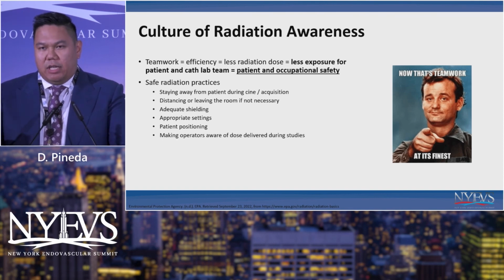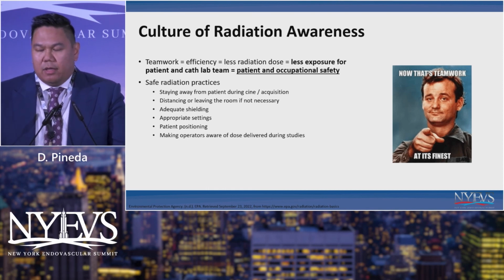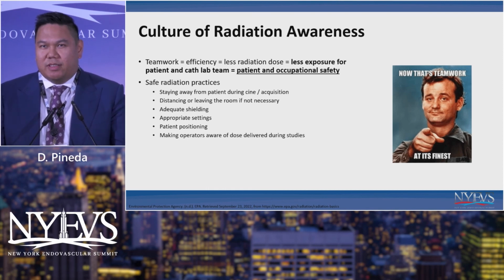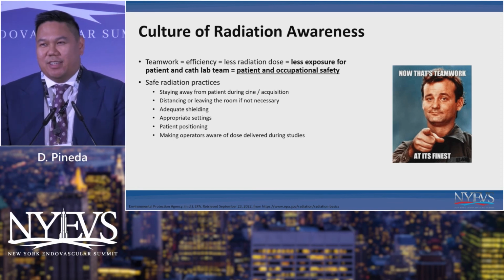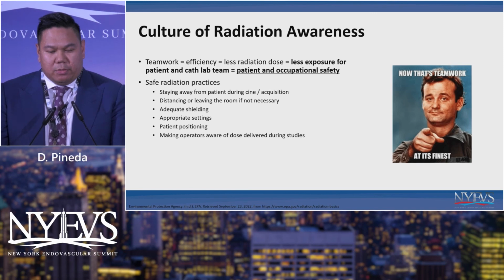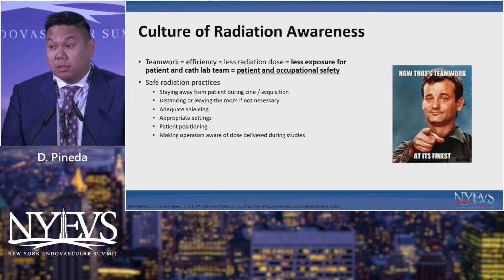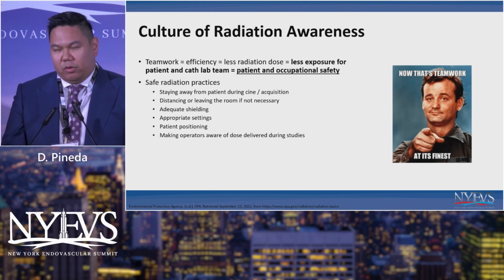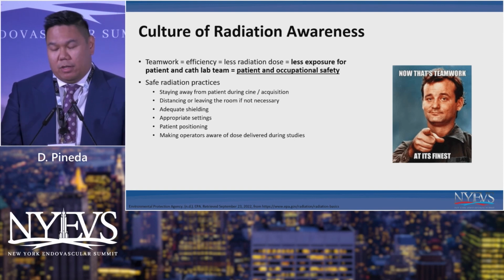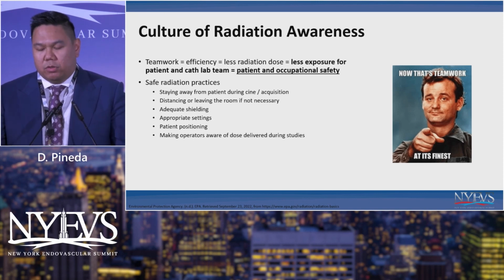The other thing is that as a team, you are monitoring. The interventionalists are very focused on what they're doing, and if they see that the image intensifier is up, we can just remind them, hey, lower the image intensifier. The same goes for the fluoroscopy settings. If you notice that this is a beautiful HD image, you would know that, hey, you're on 30 frames and there's no reason to be giving this much exposure. So this awareness is very important, in addition to monitoring the overall dose. It will improve patient outcomes, our own safety in the cath lab, and reduce the risks for both the patients and staff.